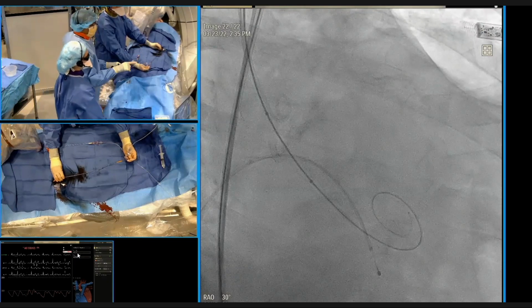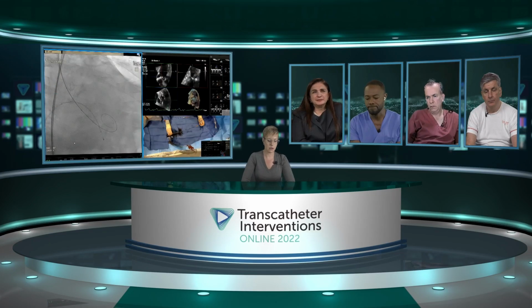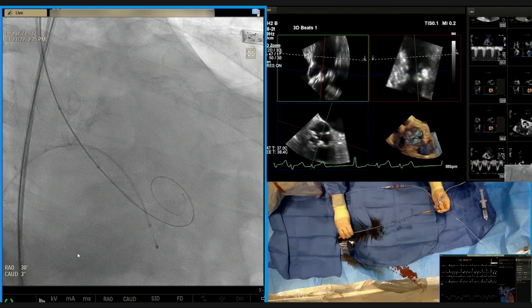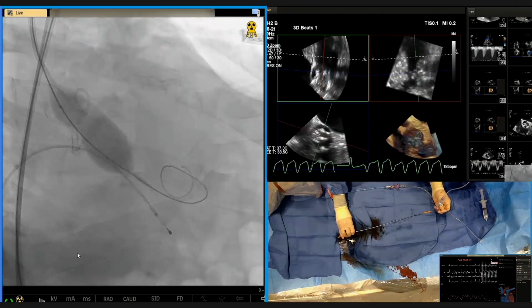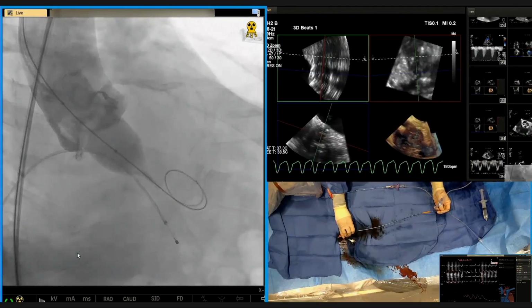So can we get both echo and fluoro after you're on the balloon? Transmission, we're going to have to go back to Erasmus. Okay. So we'll go ahead. We'll do a small injection. Everyone ready? Pacer on. Are you ready? I'm ready. Yep. Inject. Pacer off.